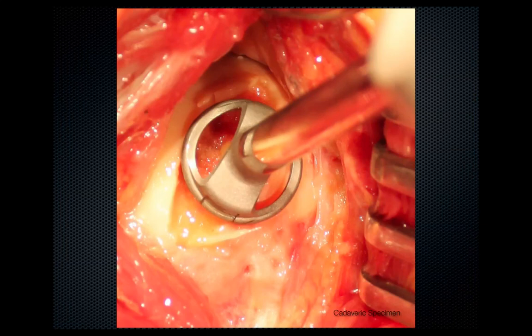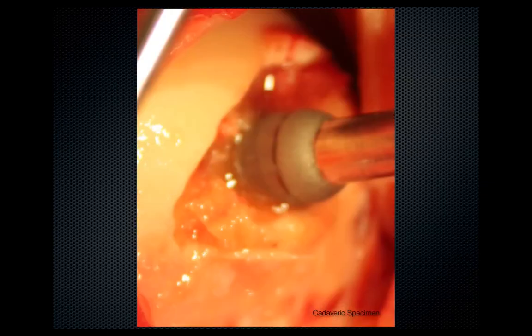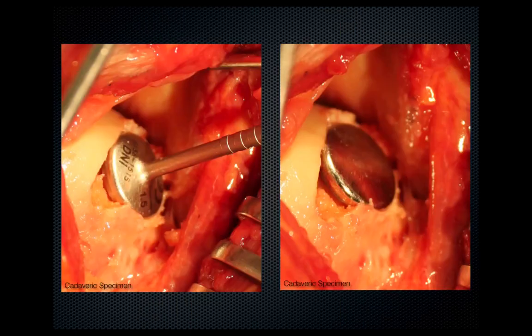We simply are aiming to fill the defect medial to lateral. The lesion is then drilled down to the appropriate depth. It is tapped before the screw is inserted. The defect is then trialled before the HemiCAP is inserted. It should be pointed out that we can always seat the screw further if it is slightly proud.